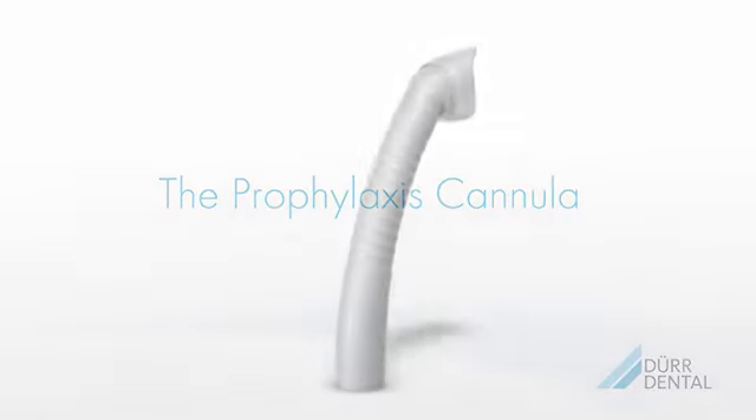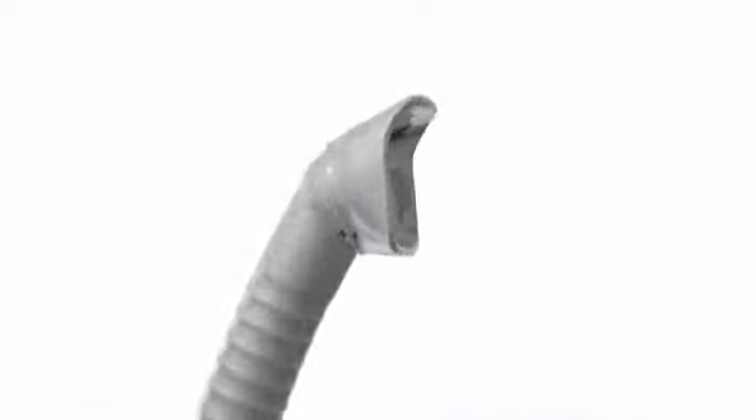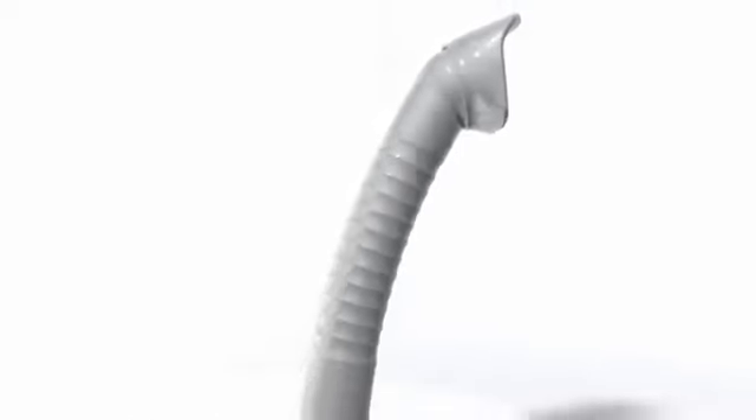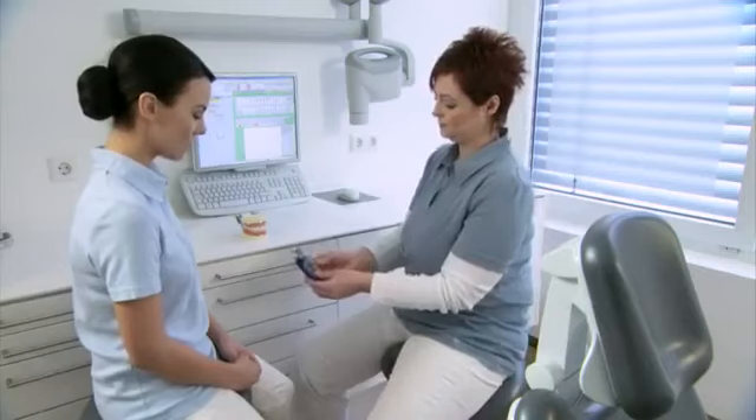The ergonomically designed prophylaxis cannula with non-slip surface is equipped with a unique protective shield. The protective shield can be rotated and set to the desired angle, thus enabling very effective aspiration of aerosol.